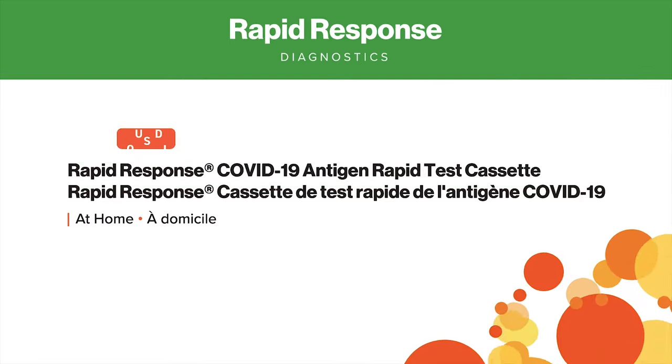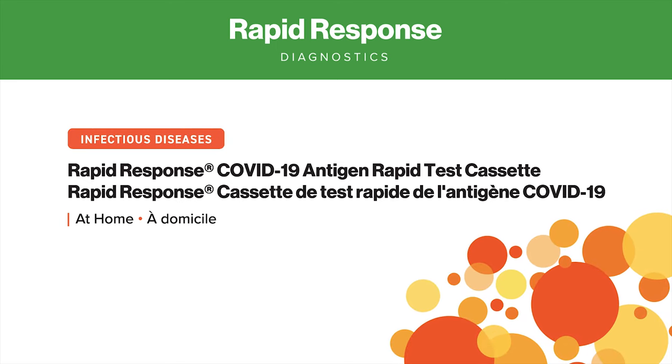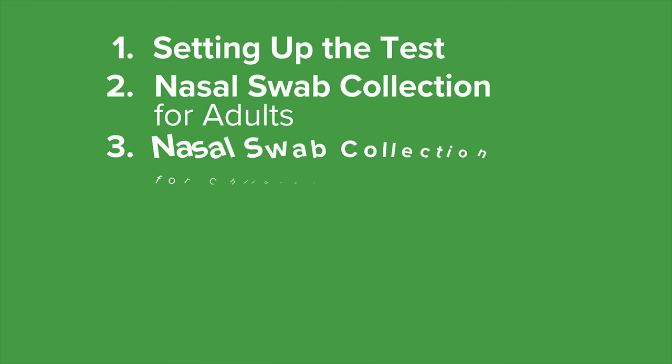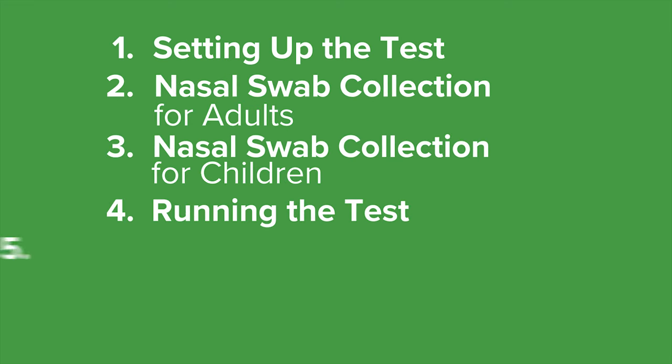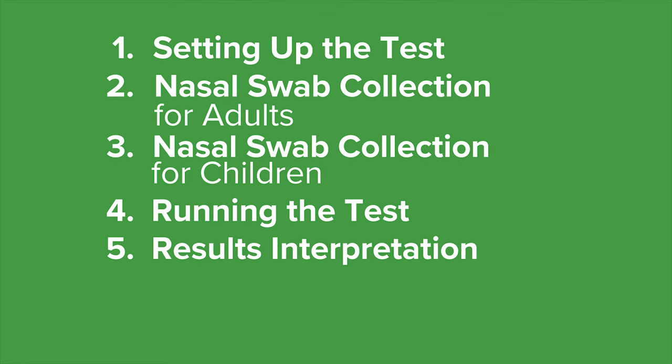This is a demonstration of how to use the rapid response COVID-19 antigen test cassette at home. This video will explain how to set up your test, nasal swab collection for both adults and children, how to run the test, and how to interpret the test results.